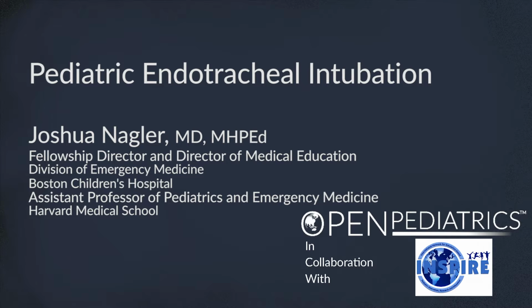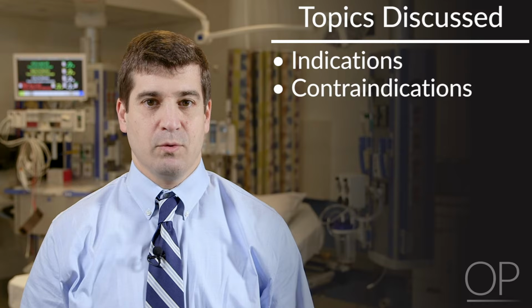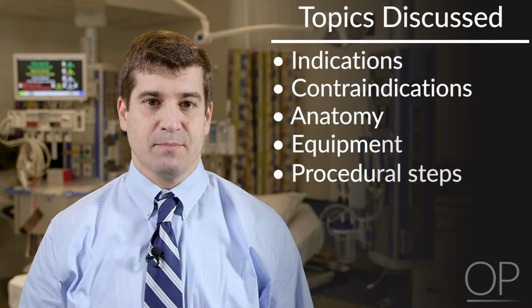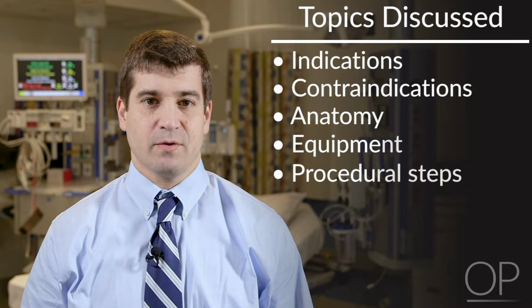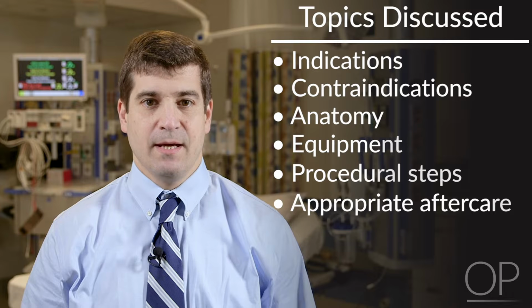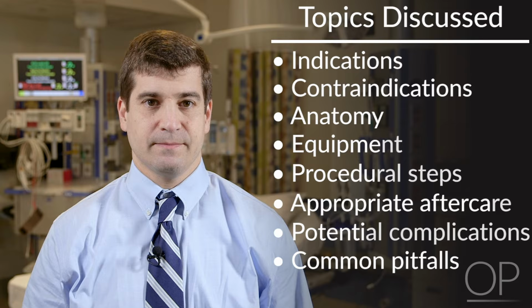Pediatric Endotracheal Intubation by Dr. Joshua Nagler. This instructional video will discuss the indications and contraindications for tracheal intubation. It will review pertinent airway anatomy and the procedural equipment. The steps required to successfully perform tracheal intubation, including appropriate aftercare, will be demonstrated. Additionally, potential complications and common pitfalls will be discussed.